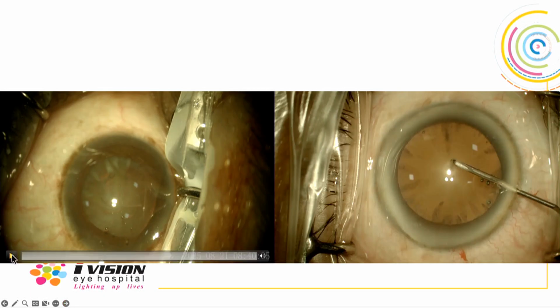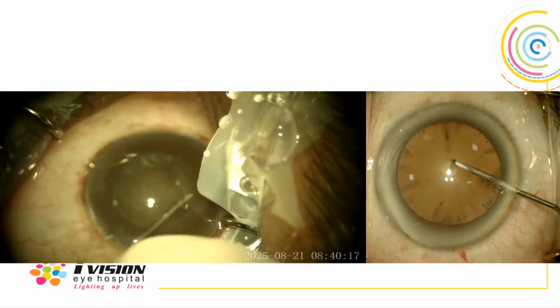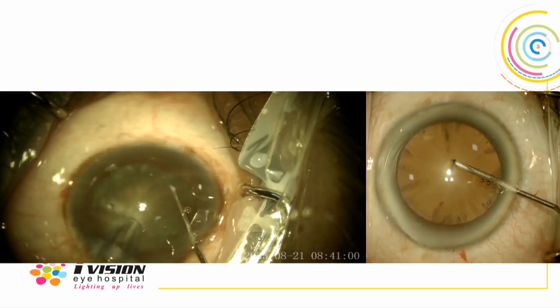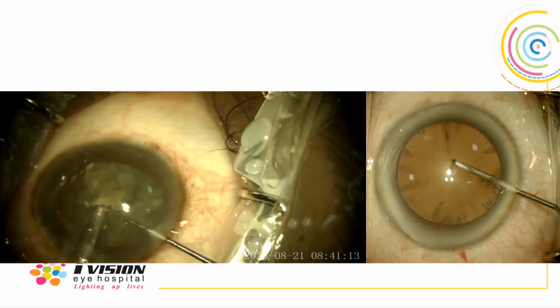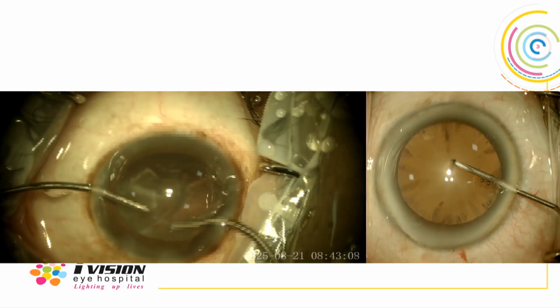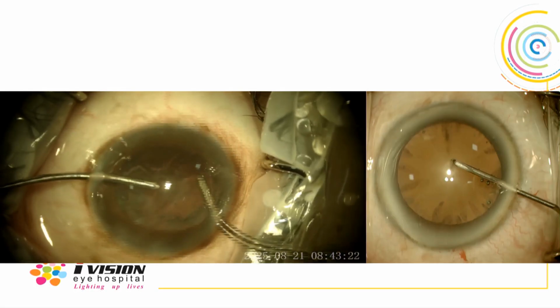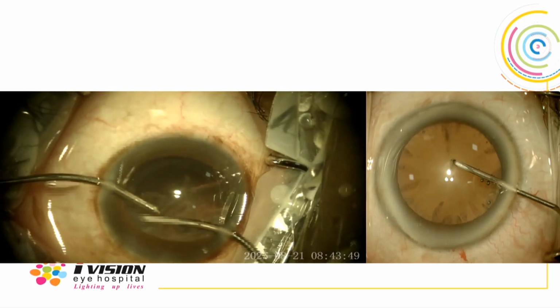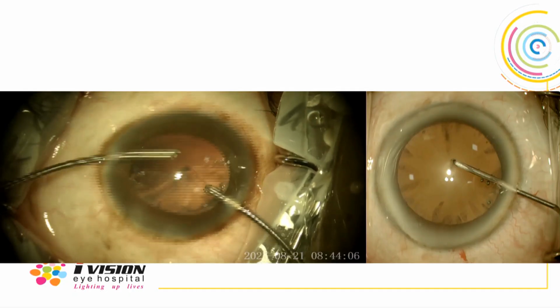And this is another cataract. This is like an ideal cataract to start with, an NS2, a firm nucleus. But I finished the phaco. But this firm nucleus had, I think, some firm epinucleus too. Probably my hydrodissection was not adequate, was not proper. A good hydrodissection will save a lot of your time in aspirating the cortex.